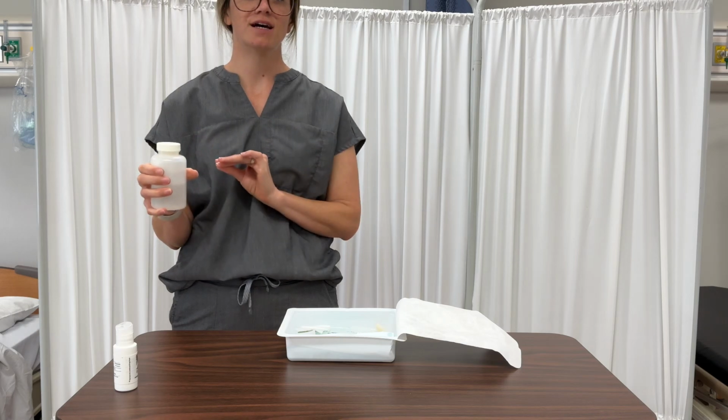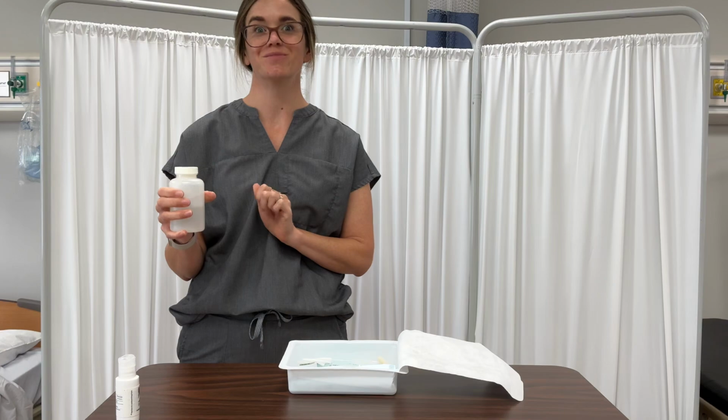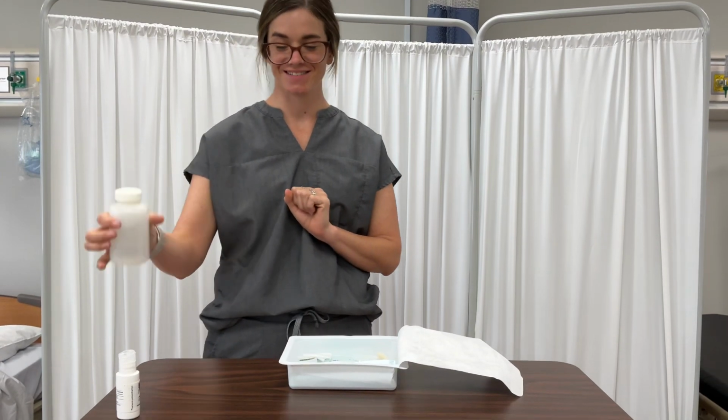And as you noticed, I didn't put the cap down. So you've got to be careful because your cap can't get contaminated either. Okay, let us know if you have any questions.